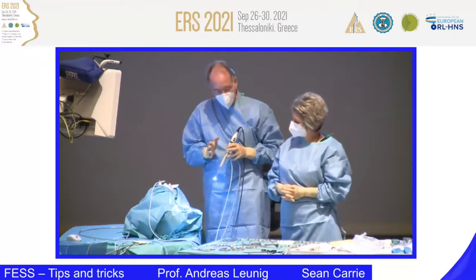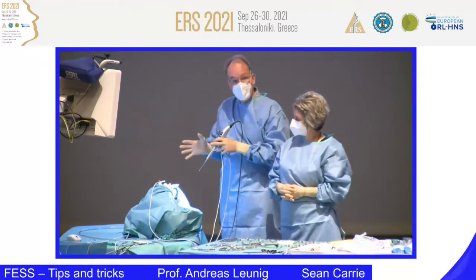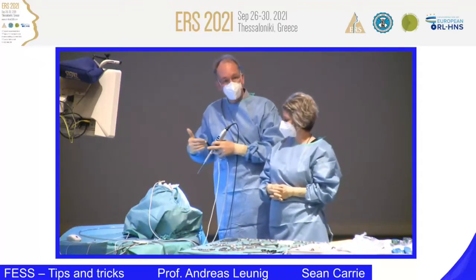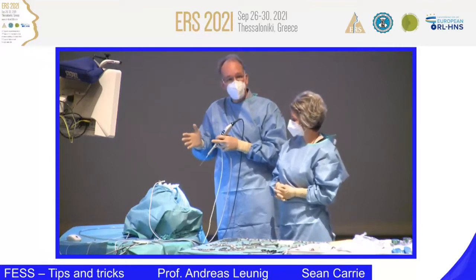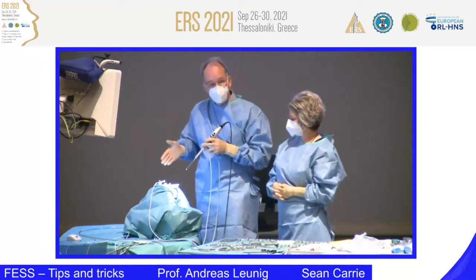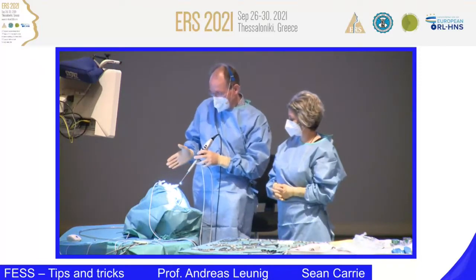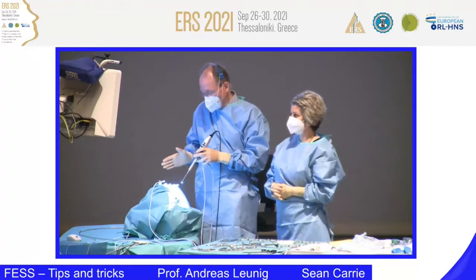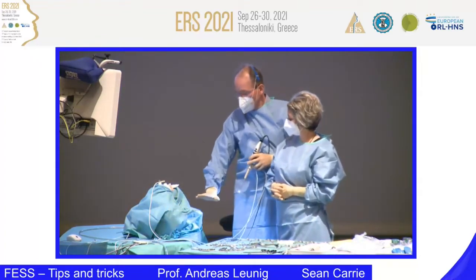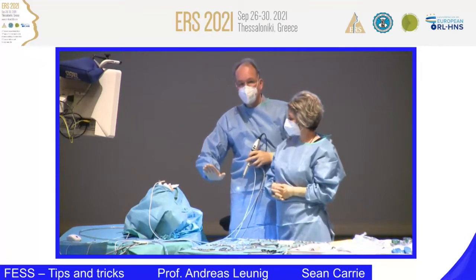So now coming to the patient. I behave during the dissection definitely like I would be in the OR. The patient is in the same position, the head is slightly rotated in my direction, and we have the upper body of the patient elevated 30 degrees.